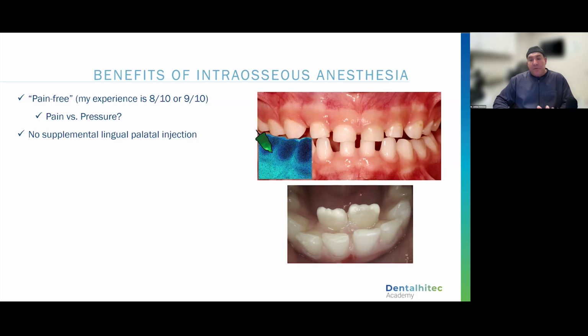And truly, if you're delivering intraosseous local anesthesia and you're truly in that cortical bone, you do not need to give a supplemental palatal injection.